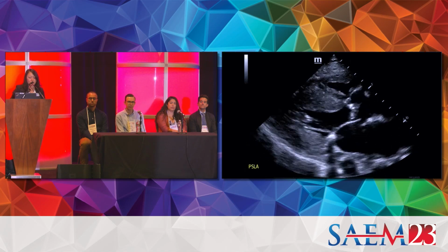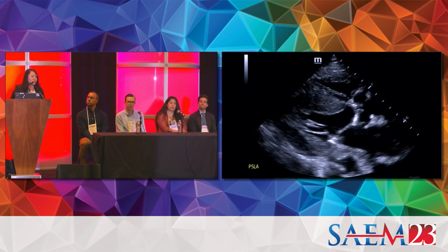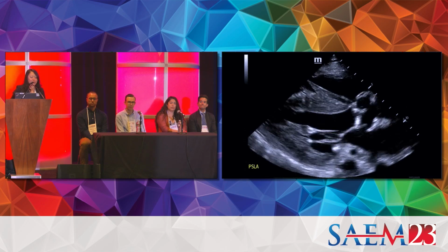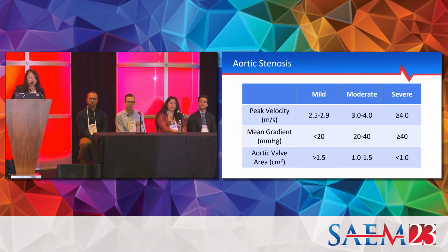So if you see this and you want to get another objective measure, so when you're talking to your cardiologist, you have something else to say, I'm really concerned about this patient, there's a couple of different cutoffs for defining aortic stenosis.